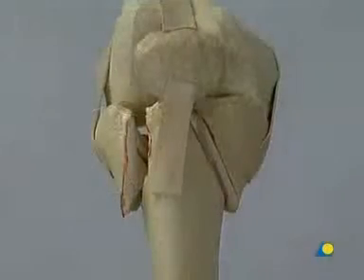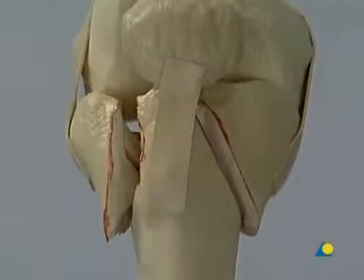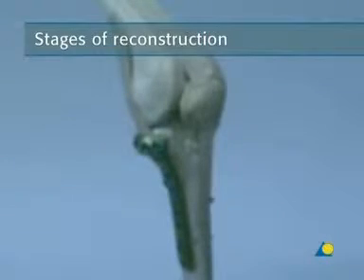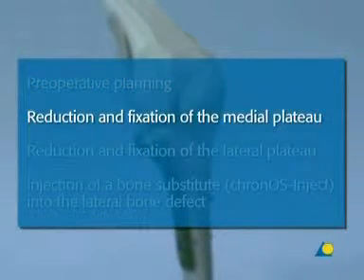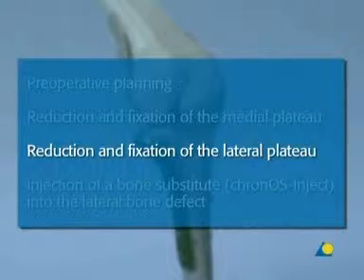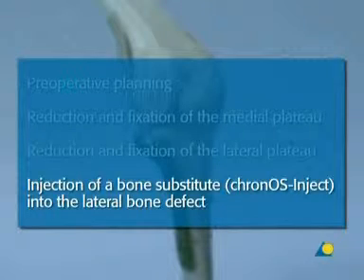The model shows a large bone block medially and considerable comminution laterally. Stages of reconstruction: preoperative planning; reduction and fixation of the medial plateau; reduction and fixation of the lateral plateau; injection of the bone substitute chronOS Inject into the lateral bone defect.